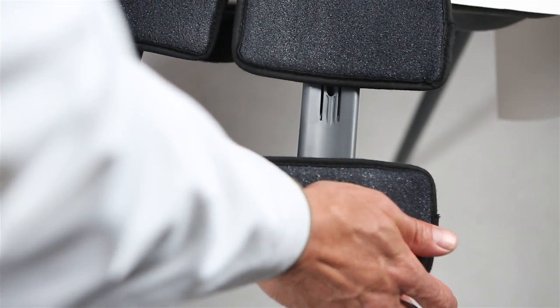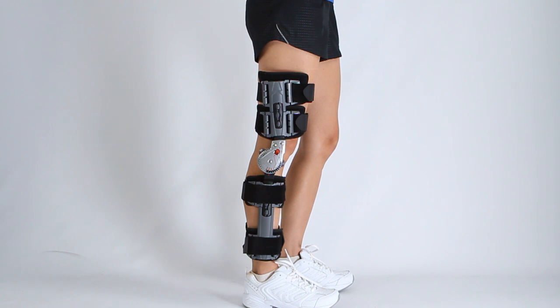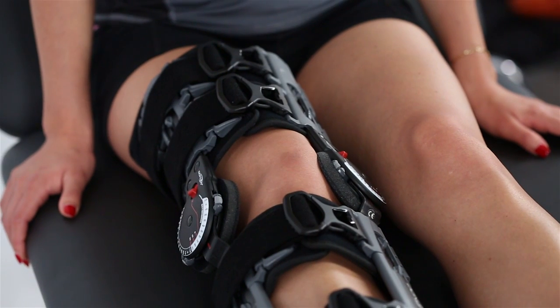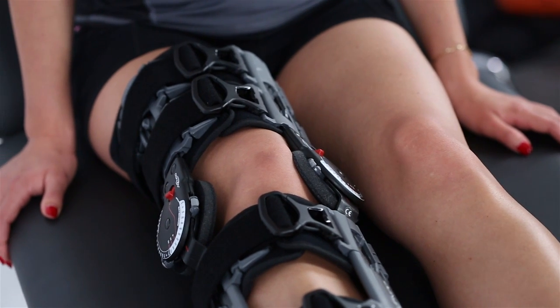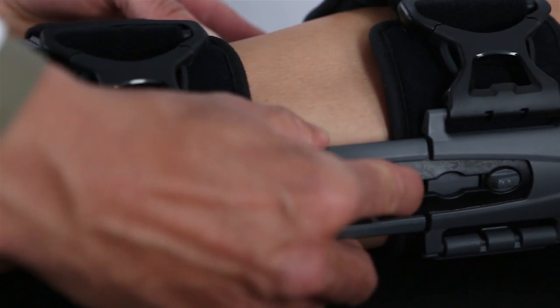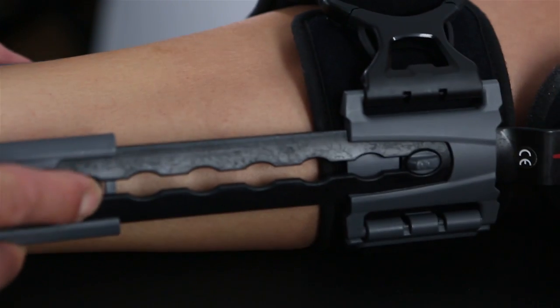On some patients, the brace may migrate down the leg. In that case, make sure the straps are snug and the uprights are at midline of the leg. You can also telescope the calf portion of the brace down to the ankle to ensure the brace stays in place.